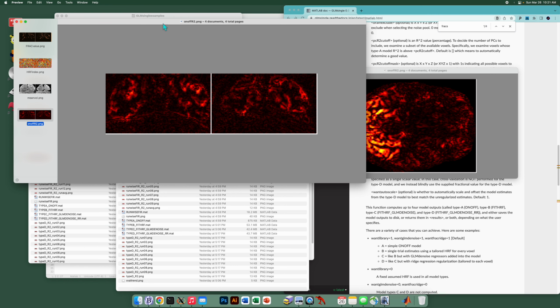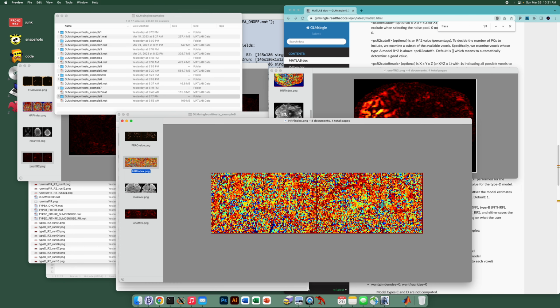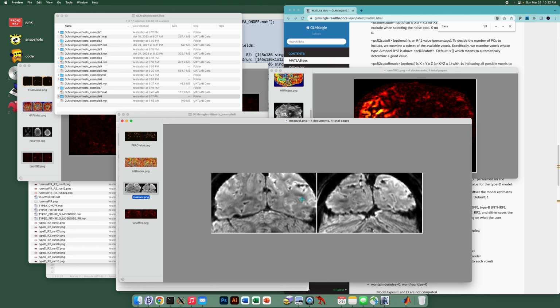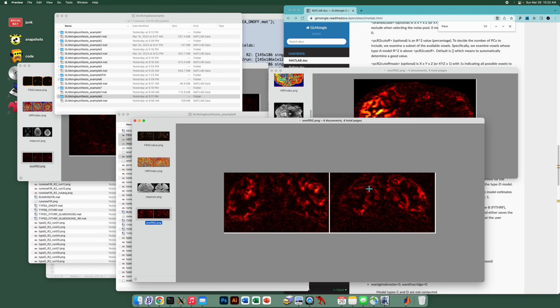Okay, so in this example, we have the usual frac value. Notice heavier regularization being used. We rarely get this very bright color, which presumably is close to 1, and often we get fractions closer to 0. The HRF index, you maybe could see some structure, but it's a little hard to tell from this view. Here's the mean volume. By the way, this is a high-res data set. This is 0.8 millimeter isotropic fMRI. And here's the on-off model.